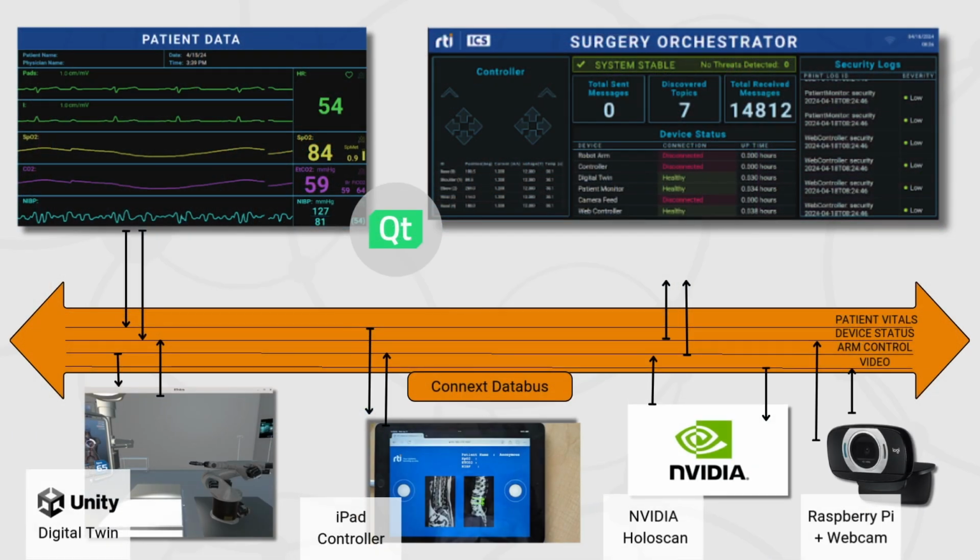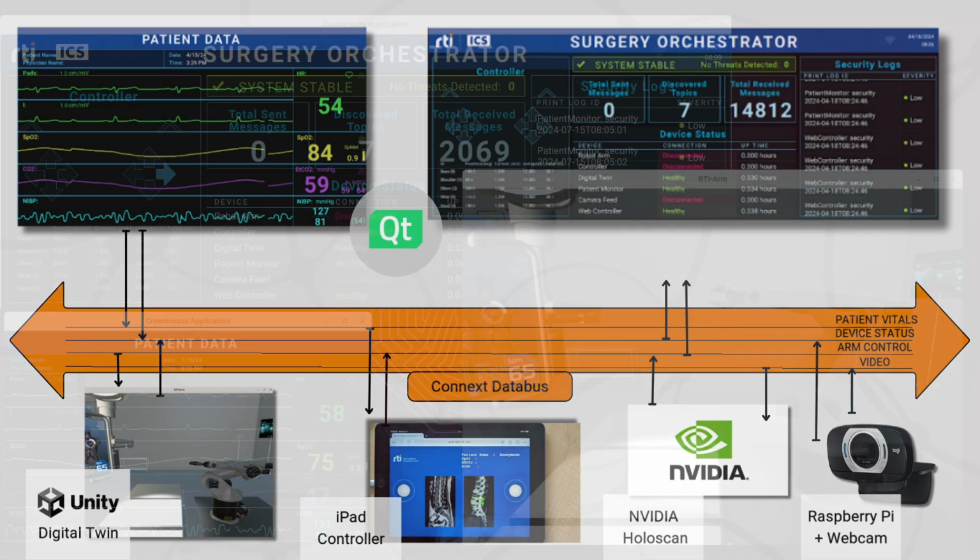This diagram presents a complete overview of the demonstration. First, we have a patient monitor application that publishes patient data. The Unity simulation shows a simulated digital twin of a surgical robotic arm. This can be controlled by an iPad or with NVIDIA HoloScan's body pose detection based on the input from a webcam. Lastly, the Orchestrator monitors the status of the various devices in the system.